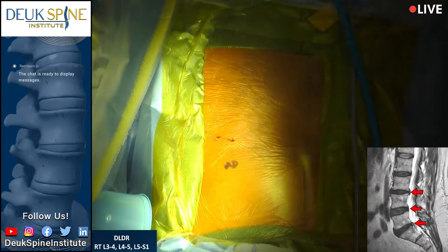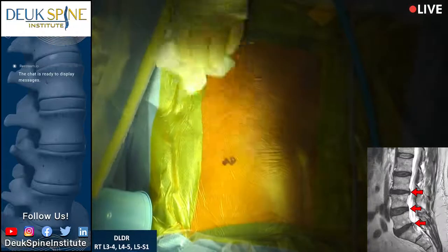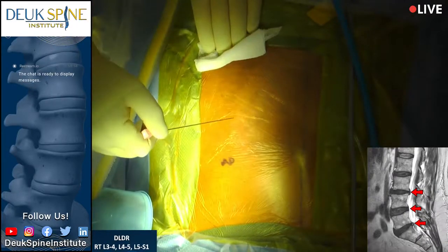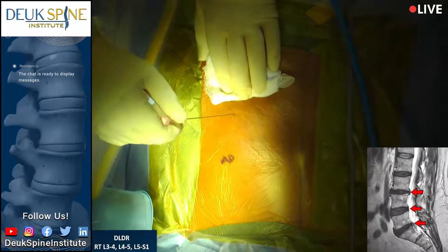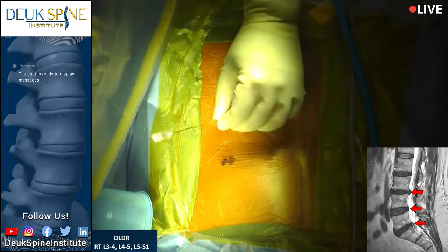As always, our patients are awake in the beginning and we put them to sleep once we gain access to the disc or discs, plural, that we're trying to get to. So we're going to start. We'll give him some more numbing medicine.